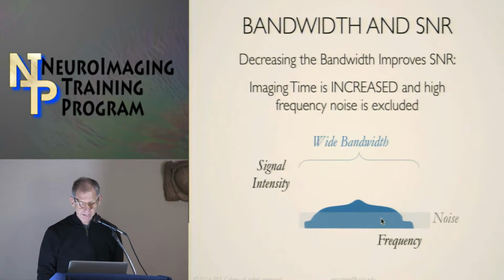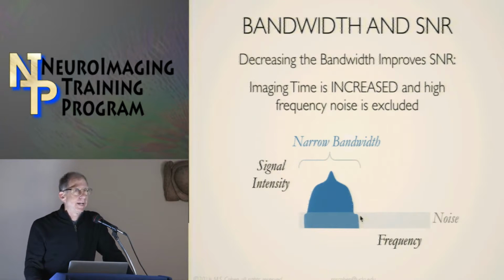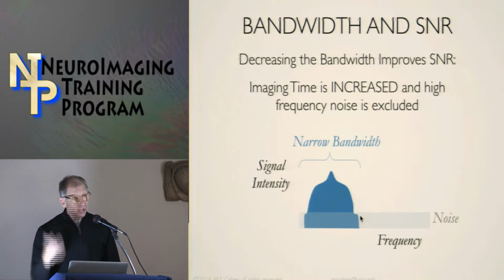On the other hand, if I concentrate the signal over a narrower band of frequencies, what happens is that the noise is picked up only over that narrower band of frequencies, and therefore I have less noise in the scans and a better signal-noise ratio. Okay? This is actually something that appears in myriad applications. I don't know how many people ever operated recording tape in a studio, but the faster the tape runs, the better your signal-noise ratio for effects that are essentially like this, that you change the bandwidth of these signals. And it's always important in making precision recordings to limit the bandwidth.